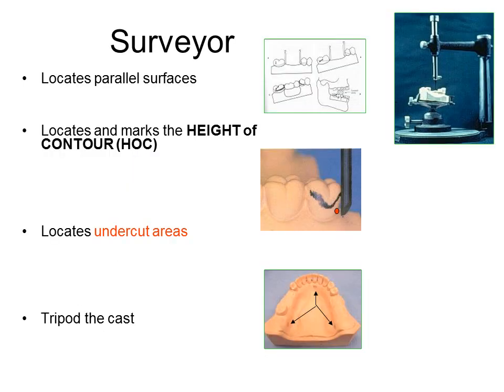The dental surveyor shown in the upper right is a paralleling instrument with numerous uses in dentistry. For clasp-retained partial dentures, it is essential for locating a path of insertion, identifying areas of retention, locating interferences, and maximizing aesthetics of the denture.